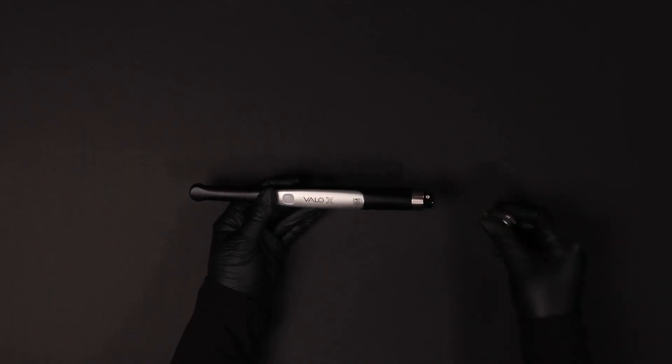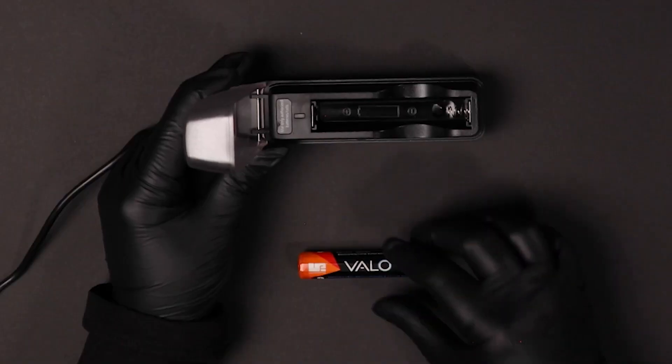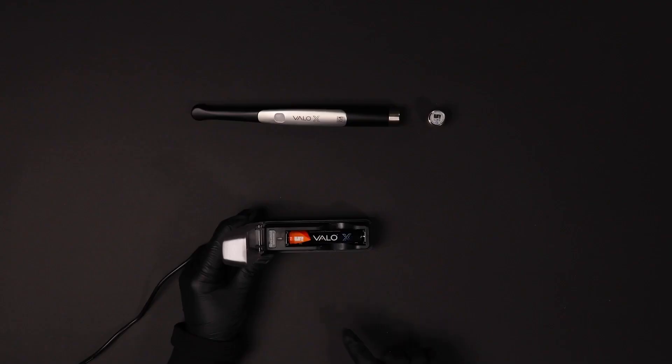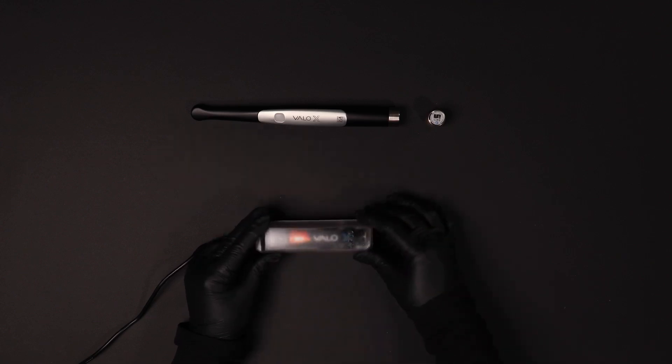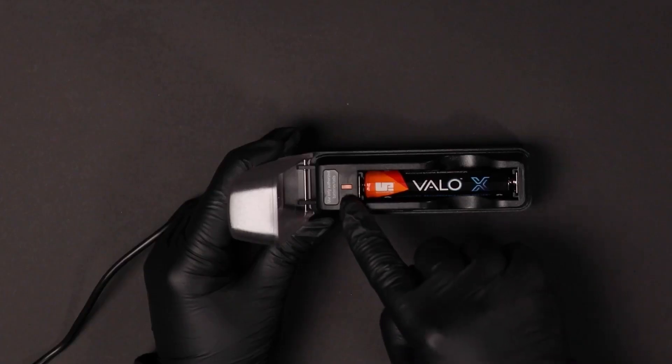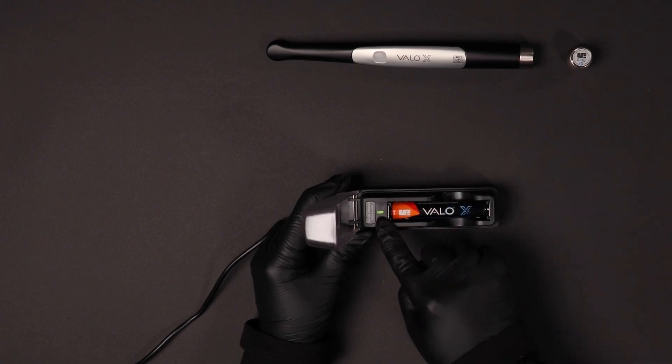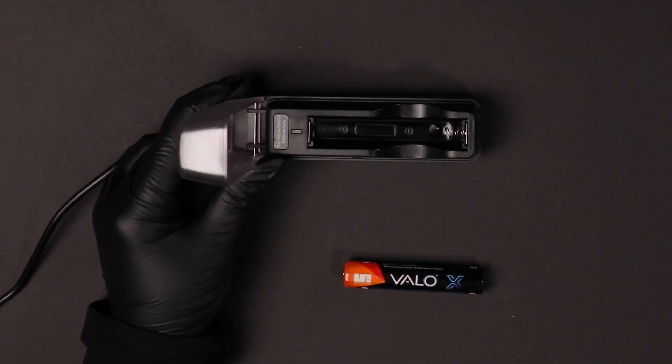To charge your VeloX battery, remove the battery from the VeloX unit. Insert the battery into the battery charger in the orientation shown in the charger. The battery can take one to three hours to fully charge. An amber light indicates the battery is charging; a green light indicates the battery is fully charged.